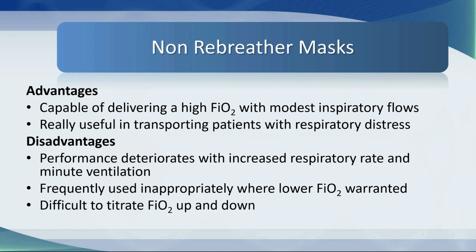And it's really, really hard to titrate the FiO2 up and down with these devices. They're pretty much all or nothing. You turn up the flow to 10 or 15 liters and hope for the best. You really don't know what inspired oxygen tension the patient is getting.